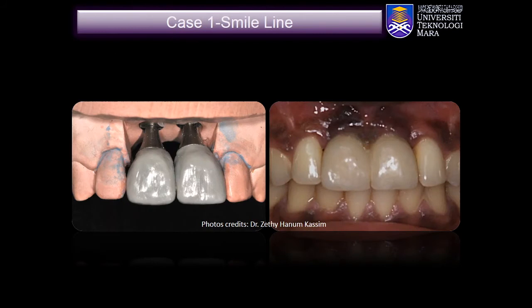The placement of implants in this patient is less than ideal. It was mentioned earlier that a minimum bony envelope surrounding a dental implant is 1.5 mm. Taking this into consideration, the inter-implant distance must be 3 mm. Failure of this has resulted in the loss of bony peak between the implants.